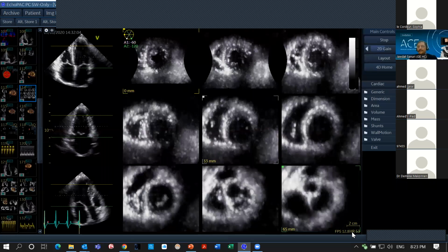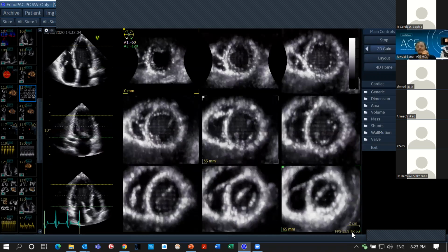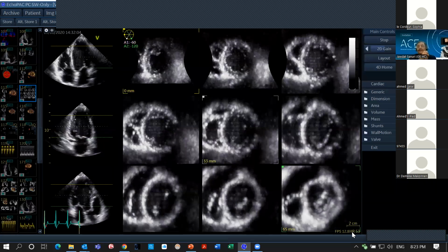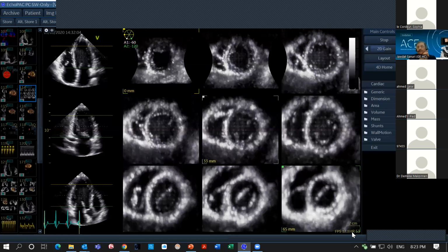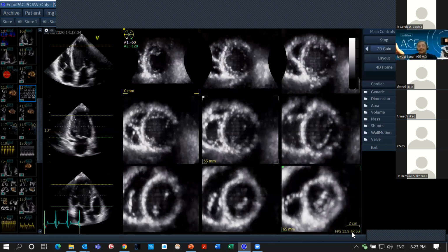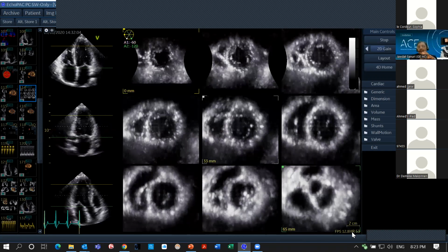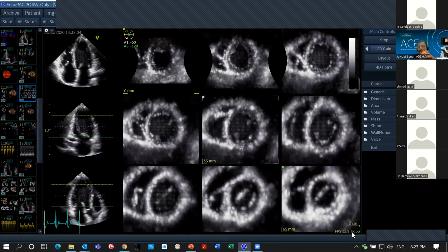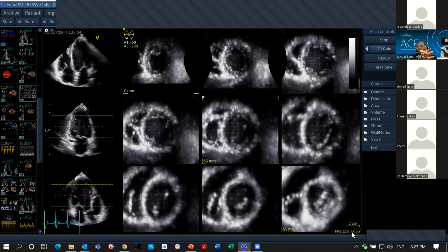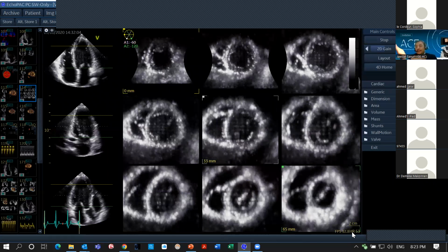Yes. So multi-beat acquisition is good for structural heart only, but not good for LV function. No, it is good for strain only, but for structural heart, no. Most likely, you're not at liberty to use multi-beat, because you want it real time. You want it live. The picture resolution will be less if I use the multi-beats. Yeah, but for structural, no, spatial resolution will be better with multi-beat.